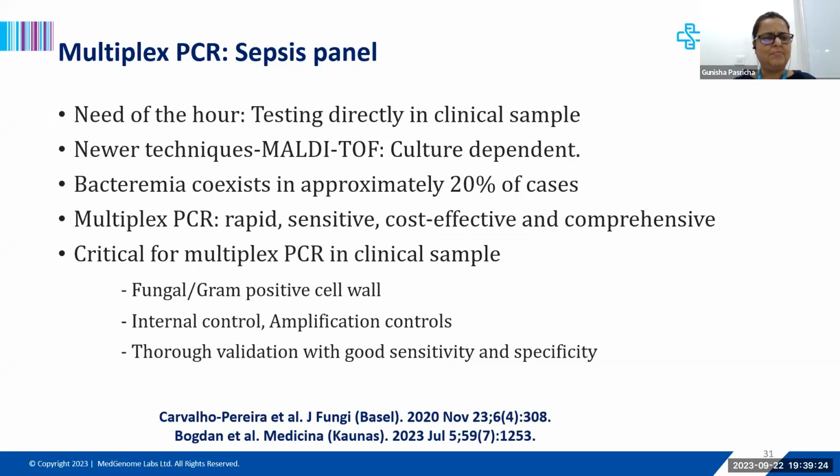So these are the sepsis options, metagenomics or NGS based, which we have with us. But since we're talking about sepsis, and this is sepsis month, I think it was on September 13th, and that is why we are all meeting up in MedGenome's initiative to talk about sepsis, I just wanted to mention again that the need of the hour is having diagnosis directly from the clinical samples.